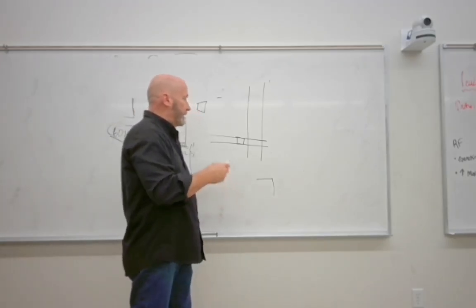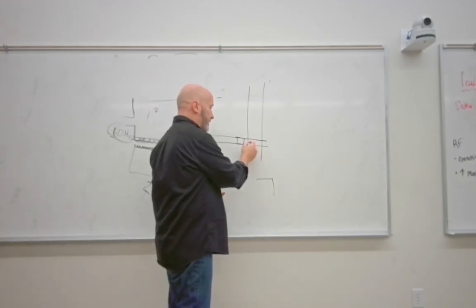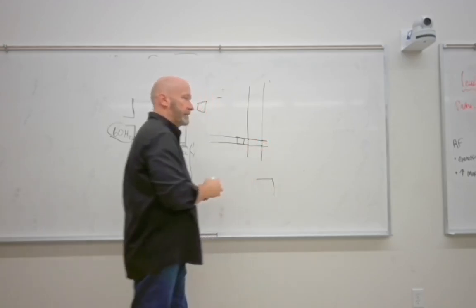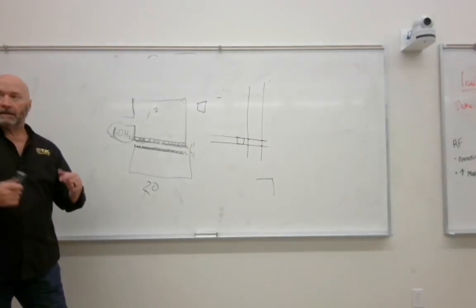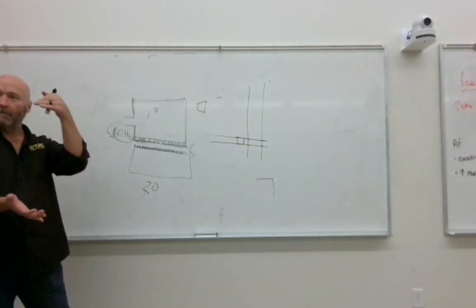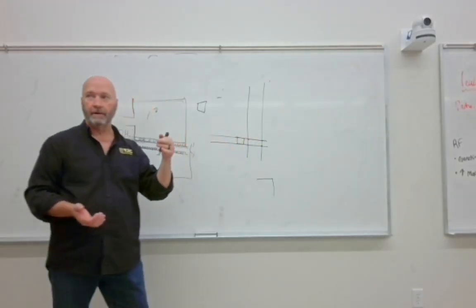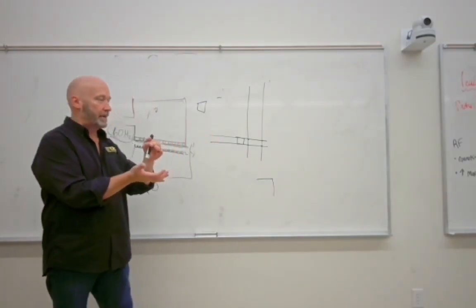So what you've got in the imaging system is, riding on these rails over here, a set of solenoids. And you can actually hear them activate if you push the buttons. You hear that clack. So what they've got is maybe a strong set of springs or whatever, mashing brakes up into this control tower. It may work exactly in the opposite direction, but let's say this is how it works.